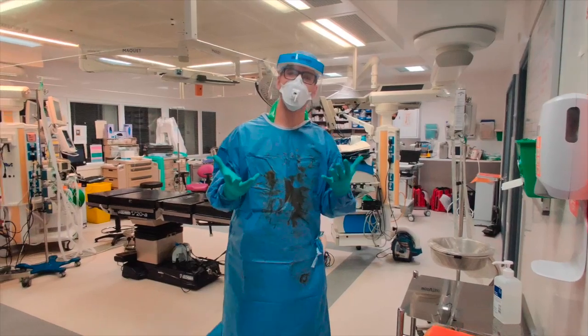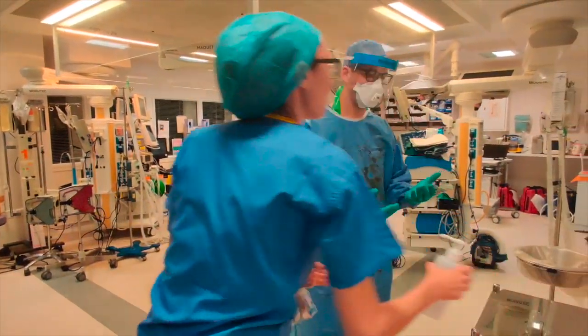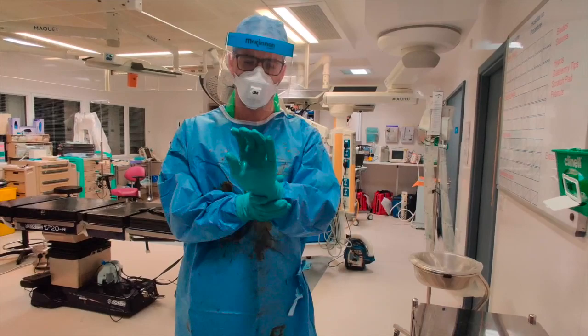The next thing I'll do is ask my buddy to come and give me some gel for these gloves. I'm going to gel those inner gloves so that they're clean.